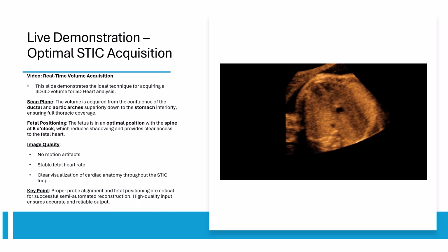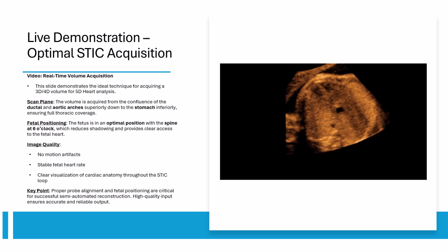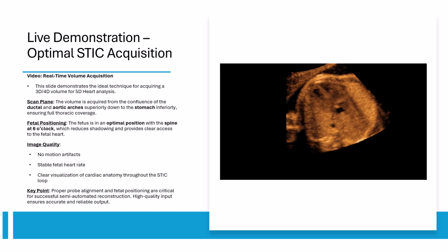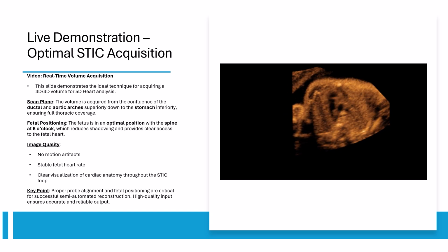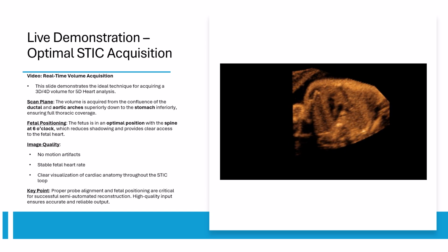The key takeaway is that precise probe alignment combined with optimal fetal positioning is essential. High quality acquisition directly translates into accurate and reliable semi-automated reconstruction during our analysis.